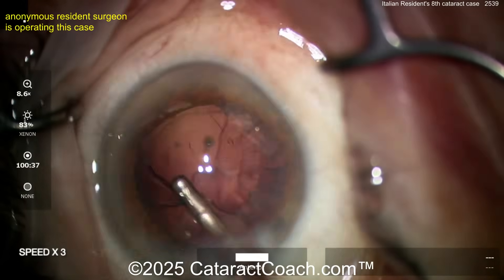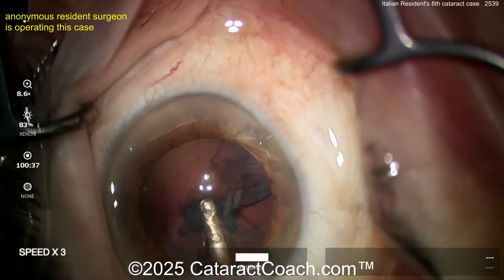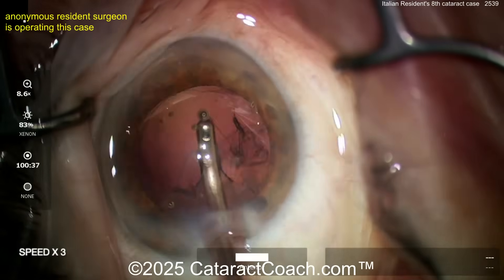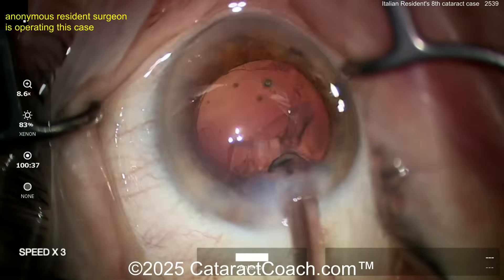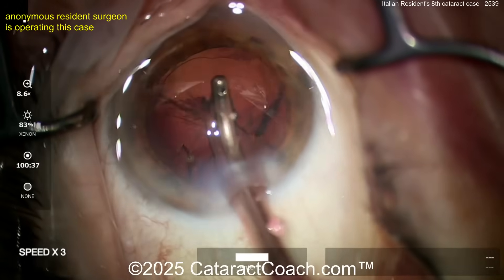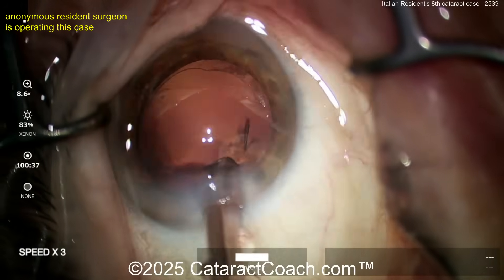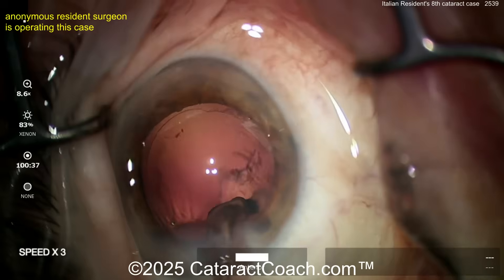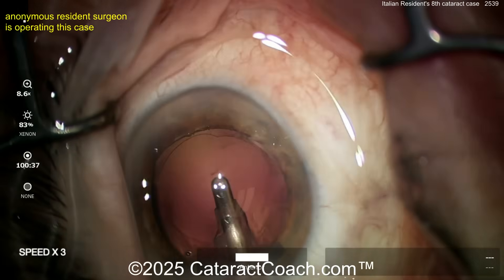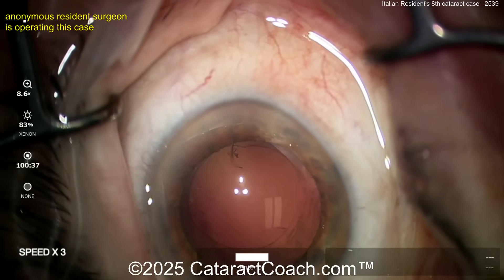The eye is not in primary — this is the part that's driving me a little bit nuts. If this was my resident, I would actually be holding your hand and pushing it over, pulling your arm over, getting this eye in primary the entire time. I won't let you default to the eye being pushed up against the upper lid — that's no bueno. The cortex is coming out nicely though, so the technique is there. You've obviously learned from the videos, but it's just putting it into action. My goal for you for your next case: don't worry about anything other than keeping the eye in primary.